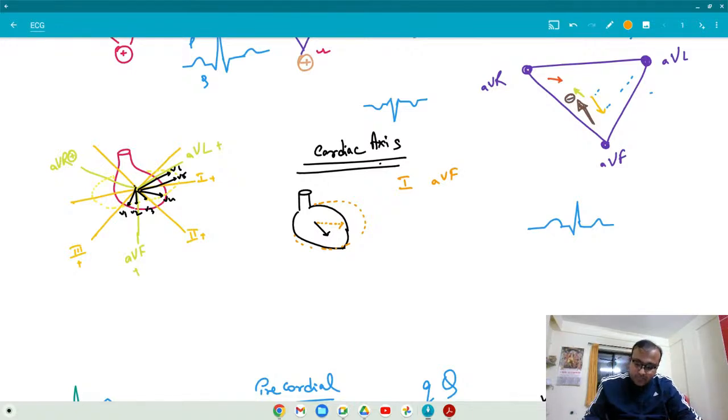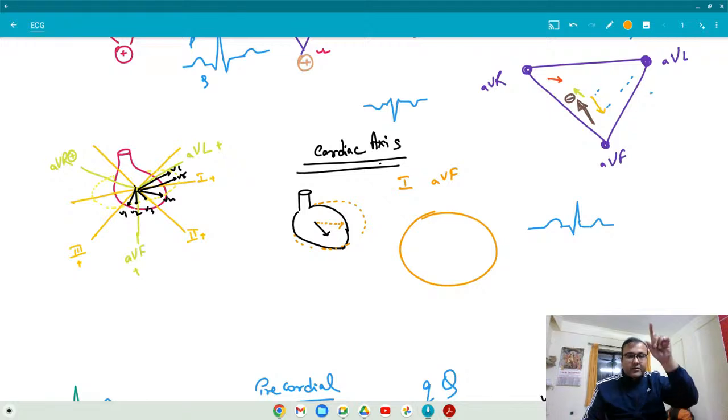So ideally, suppose I consider this to be the axis, 0 degree, 30 degree, 90 degree, that hexaxial system that we have discussed. This is zero, lead 1. Then this one was minus 30, then minus 60, then minus 120, like that it was going. This one was the downside, I told you last class. Downside positive: plus 30, plus 60, plus 90.